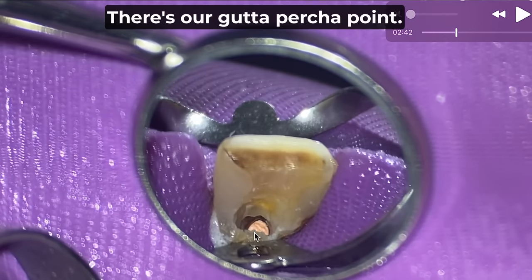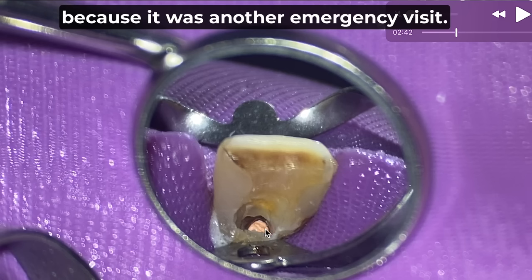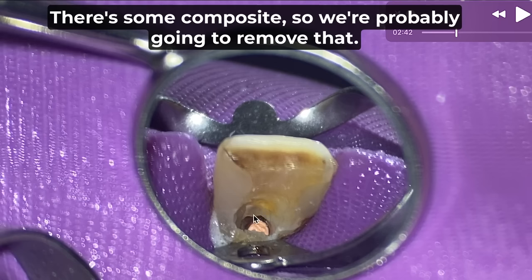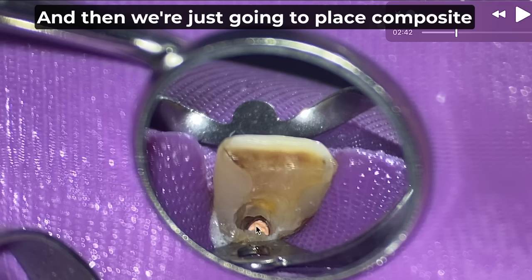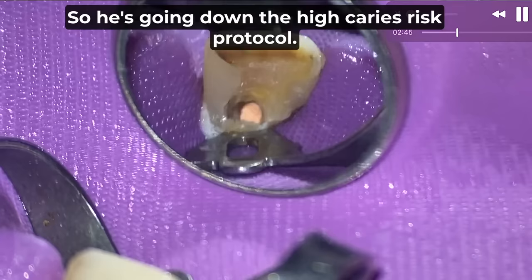Okay, so there is our tip. There's our gutta percha point. Now you can see this is stage two of this, because we did place calcium hydroxide in this case because it was another emergency visit. There's some composite, so we're probably going to remove that, and then we're just going to place composite. This is a very high caries risk patient, so he's going down the high caries risk protocol.